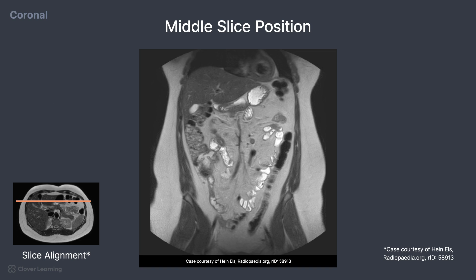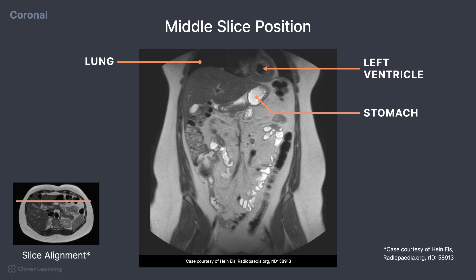At this slice, we can see the air-filled lungs again, with a portion of the left ventricle of the heart. The stomach is visible, and fluid within appears bright due to this being a T2-weighted image.